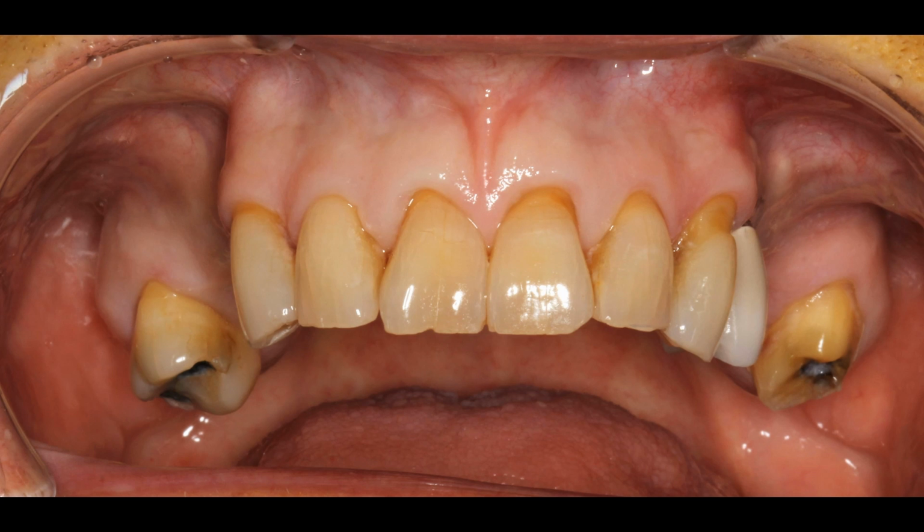He knew these 7 front teeth would need new crowns. So that alone was going to be over $10,000. So he elected to put that money into a fixed temporary.